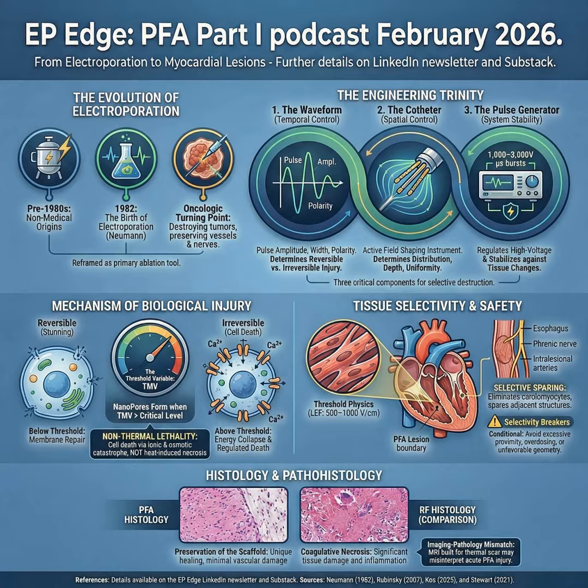Next is the catheter, because waveform is time, but catheter is space. If waveform defines time, the catheter defines space. The catheter is not a passive delivery tool. Electrode size, spacing, and configuration determine field intensity at tissue surfaces, penetration depth, and field uniformity. Small geometric changes can create large differences in peak field intensity, steep gradients at lesion borders, and unexpected exposure in the blood pool. Modern PFA often uses multipolar designs, distributing energy over a larger area to reduce hotspots.